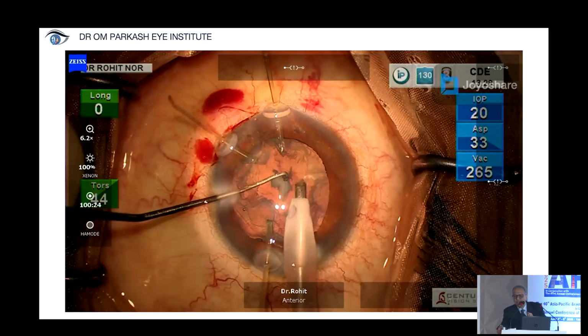Dr. Chi, any comments about that? Would you like to add? I think just once you have hooks in place, to me, as long as you fully fill up the bag and distend the bag, it doesn't matter which way you go. Yeah, but if that has not been done, then you go from intact to non-intact. So that is a very important factor, because yesterday Dr.